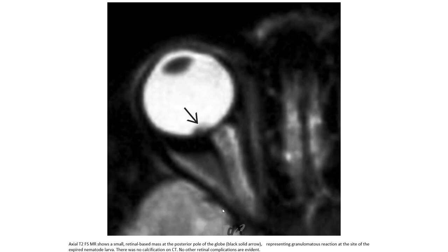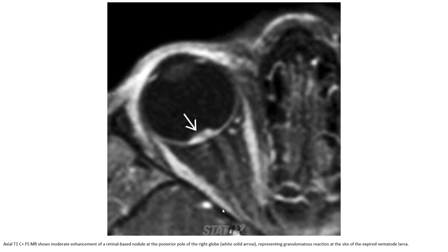The second case shows an axial T2 MRI with a small retinal-based mass at the posterior pole of the globe, representing a granulomatous reaction at the site of the dead nematode larva. There was no calcification on CT and no other retinal complications. The axial T1 with contrast and fat suppression shows moderate enhancement of the retinal-based nodule at the posterior pole of the right globe, representing a granulomatous reaction at the site of the nematode larva.